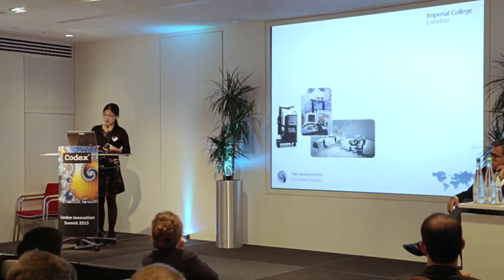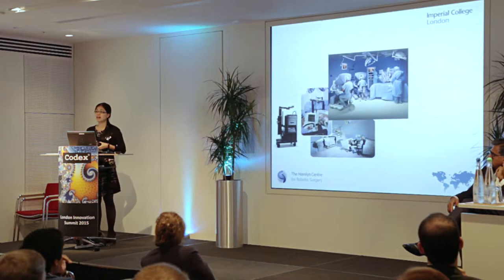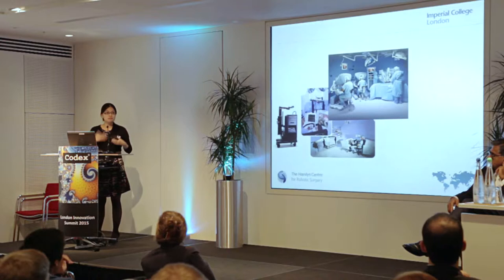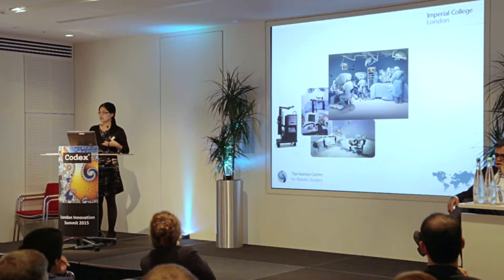That one actually is the Da Vinci system by Intuitive, and that one's in use all around the world, mainly for prostatectomies, but we're using it for other innovation as well, since the company has been so kind as to open up their framework and allow many academic institutions to develop directly on their platform.